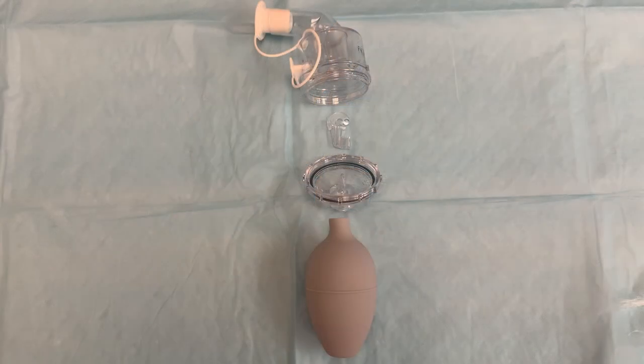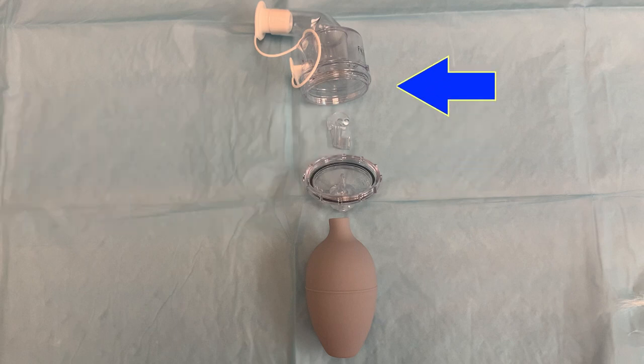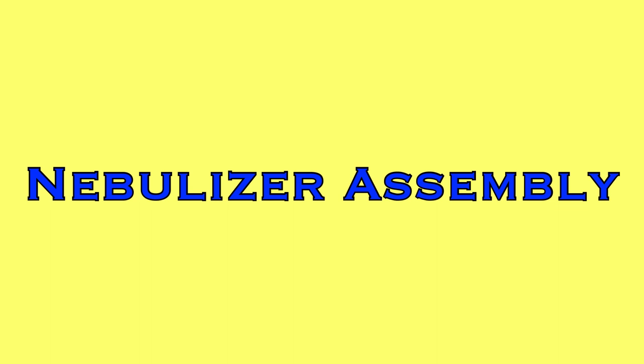Each nebulizer is made of four main parts: the bulb, the base or reservoir, a question mark shaped nebulizing insert, and the lid with two plugs attached. Also included with the nebulizer is a small wire loop, which is a tool for cleaning the nebulizer tip. To begin, let's look at how to properly assemble a nebulizer.